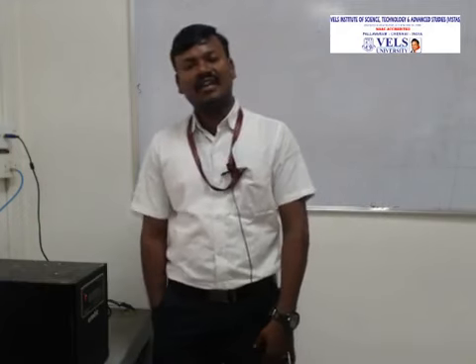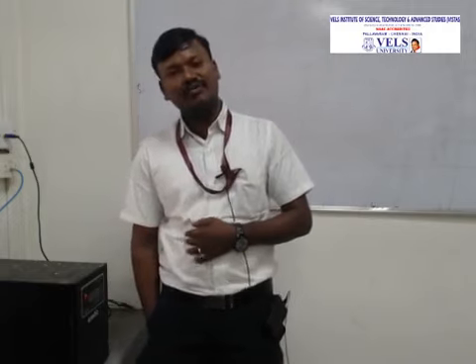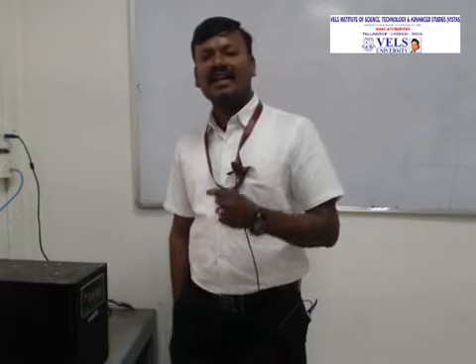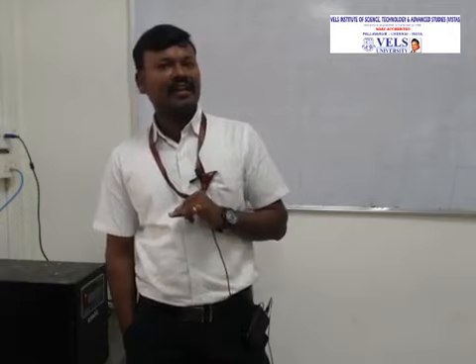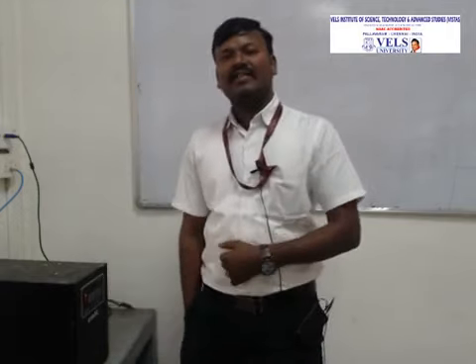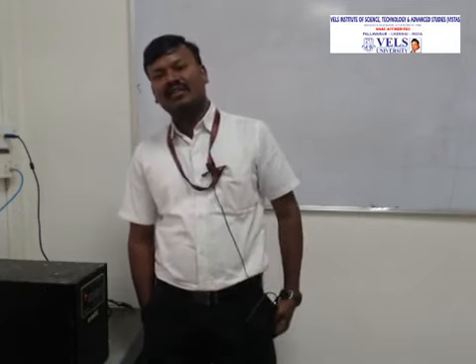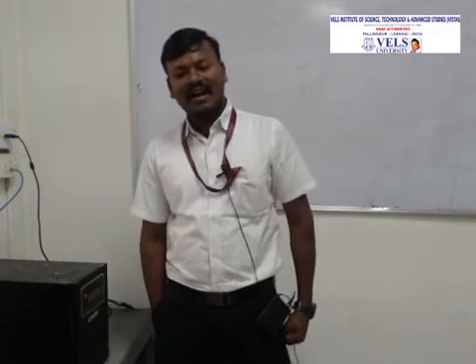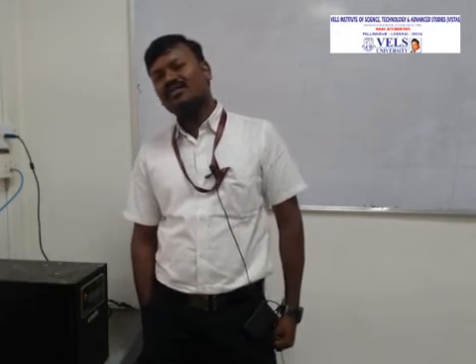This technique involves the creation of a precise gap in the zona pellucida of selected embryos using a 1.48 micron infrared diode laser. See, the first one uses a needle, the second one uses a chemical, that is acidic Tyrode's. The first is the glass needle, and the last one uses a laser. Here the 1.48 micron infrared diode laser is used to create a gap in the zona pellucida.